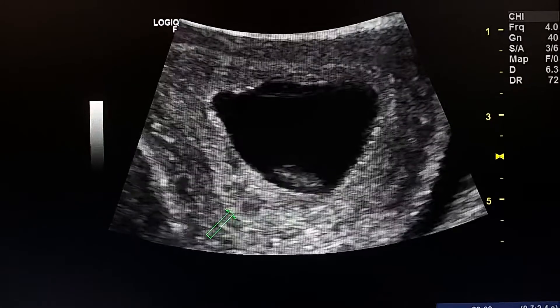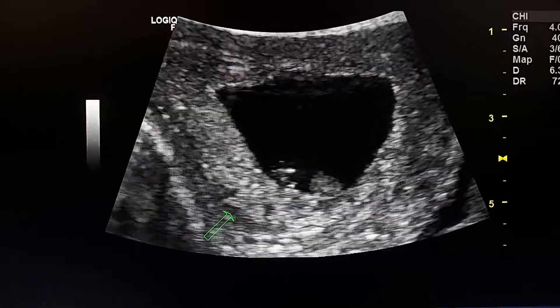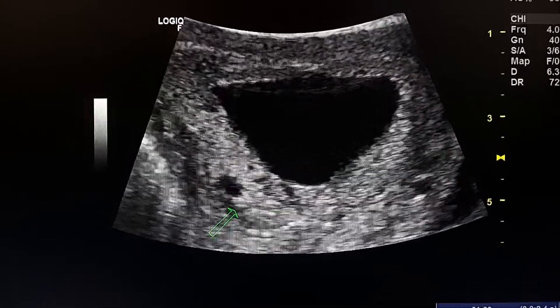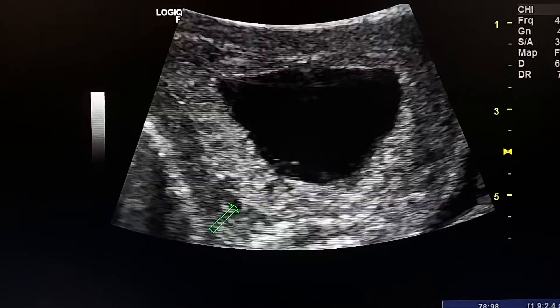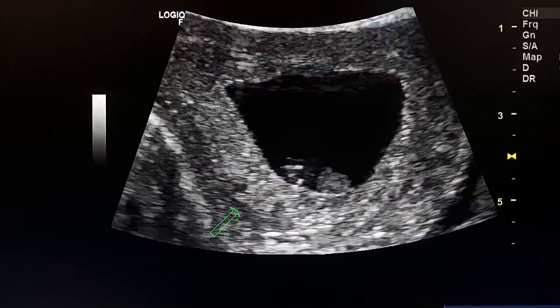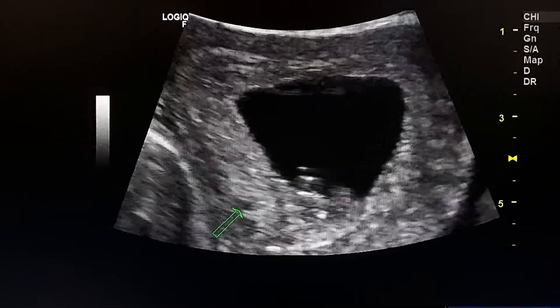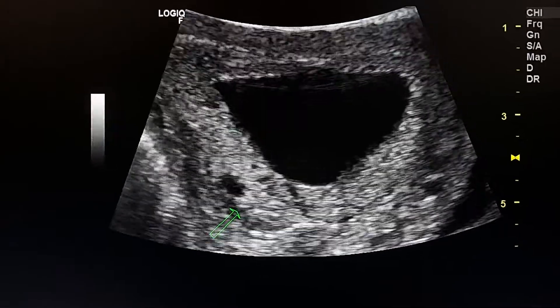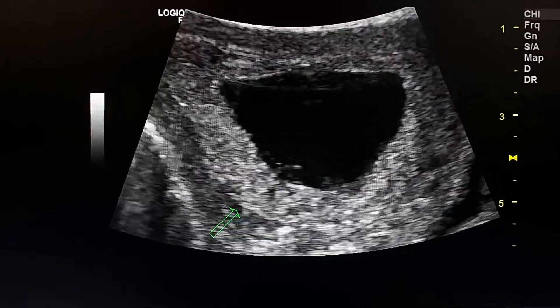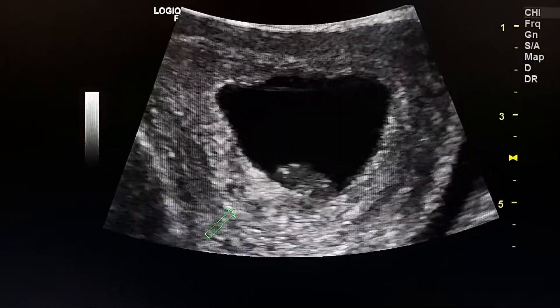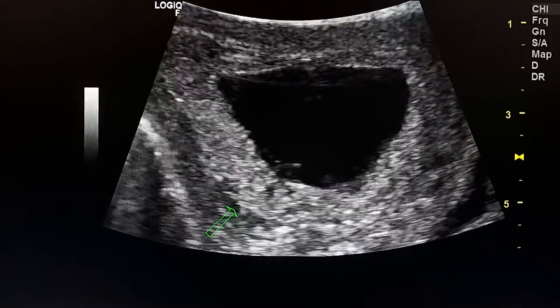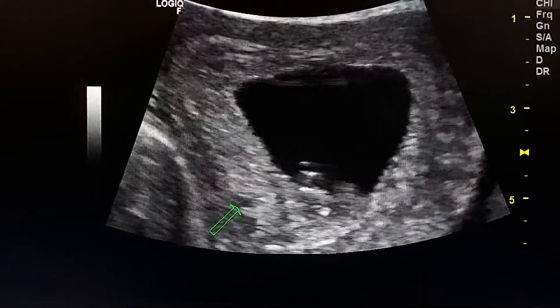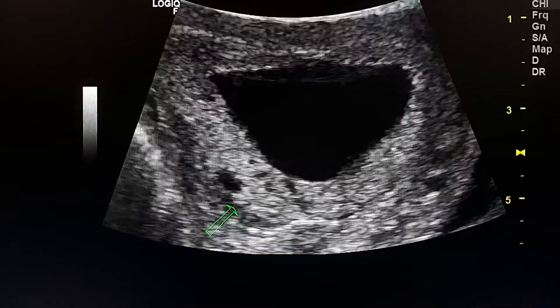Here we see another sign of early pregnancy failure in the gestational sac: hydropic changes in the gestational sac wall. We see hypoechoic areas, which are the cystic areas.